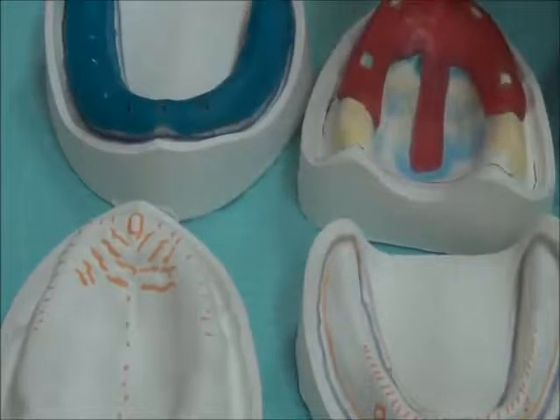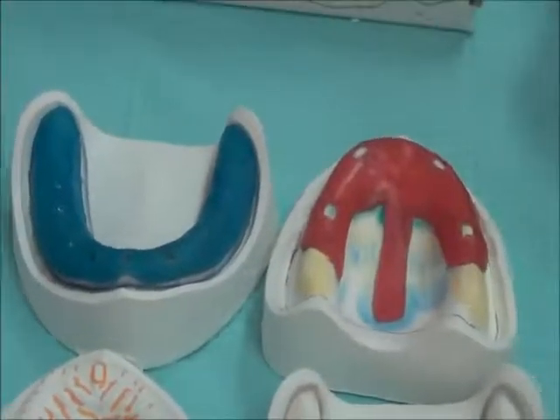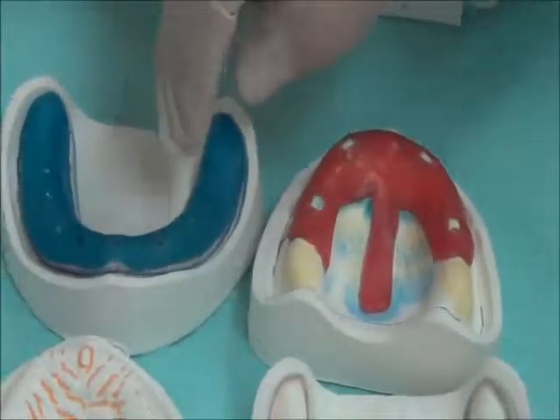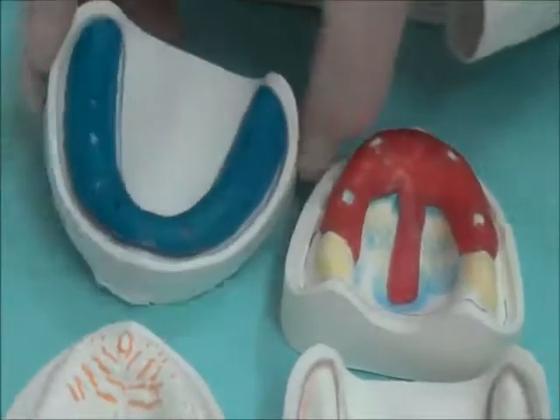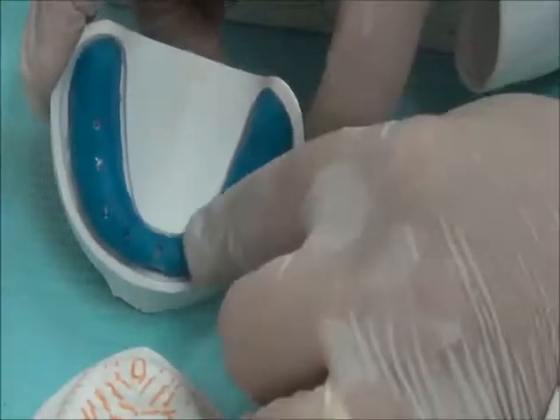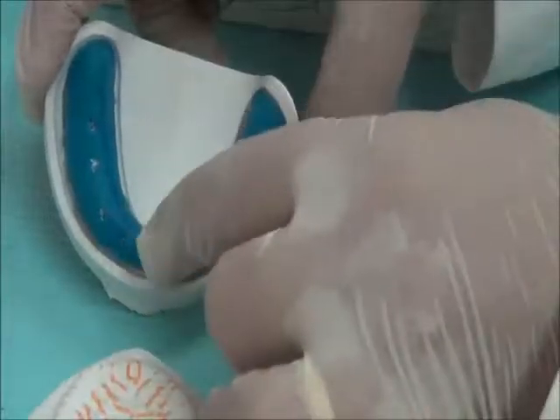We could relieve in different ways. Putting a spacer and then removing it before impression does this relief. Or we can fabricate a tray that has no spacer in it, but in the areas we need relief, just before adding the handle, we put in holes.